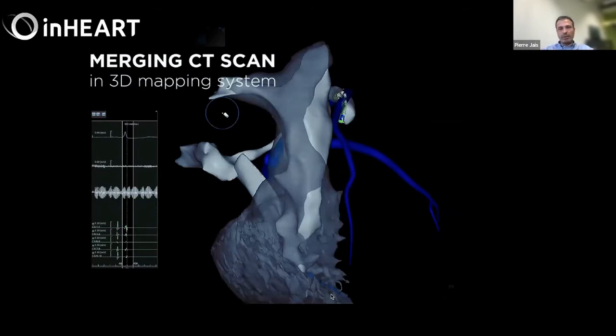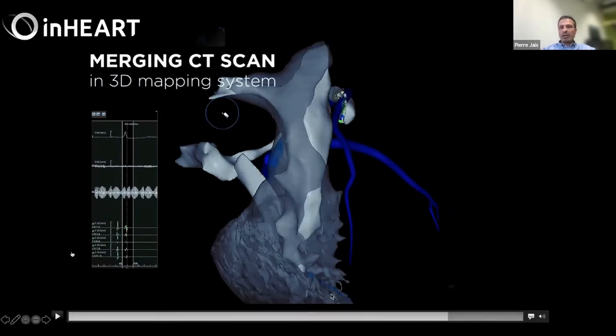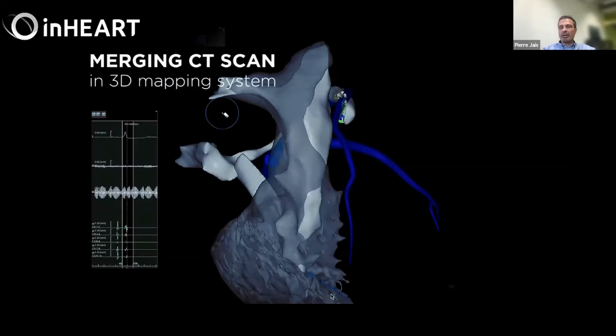I told you not to use the atria, and this is because we did that in the past and it didn't work. Simply, you get obvious registration issues doing that. Again, that's because they are acquired during the image in systole and in diastole with your ablation catheter if you try to map them quickly. So it simply doesn't work. That's really important to understand.